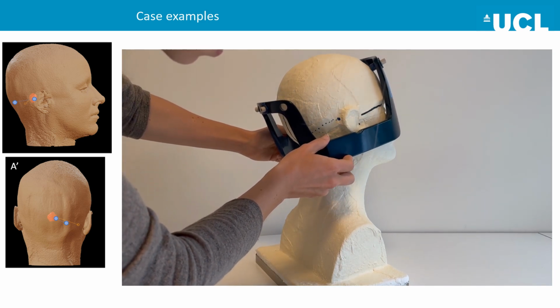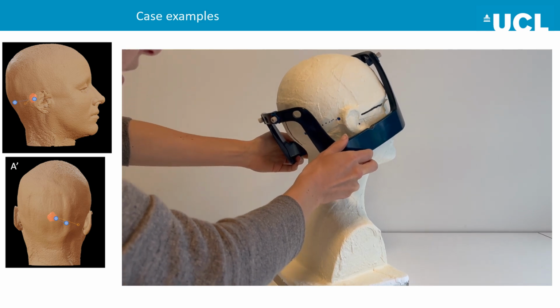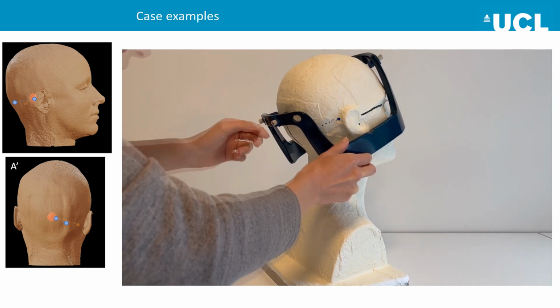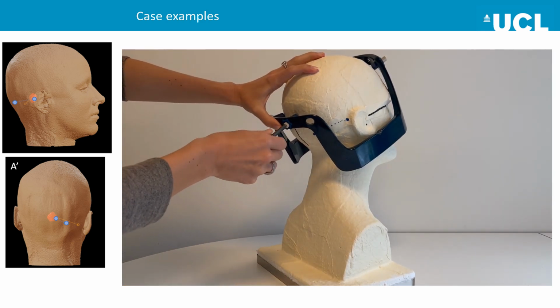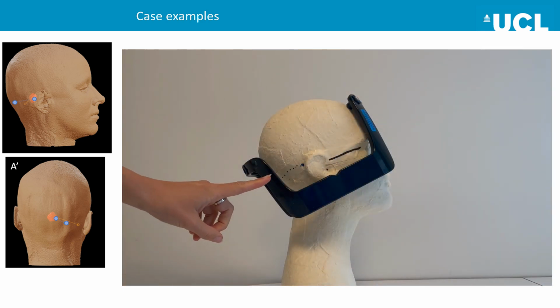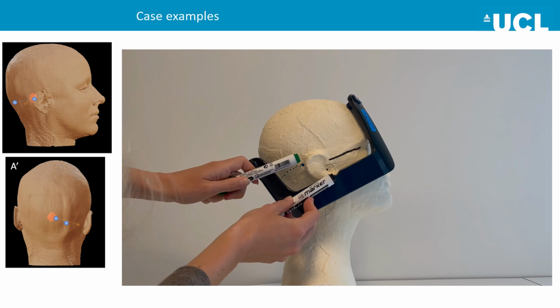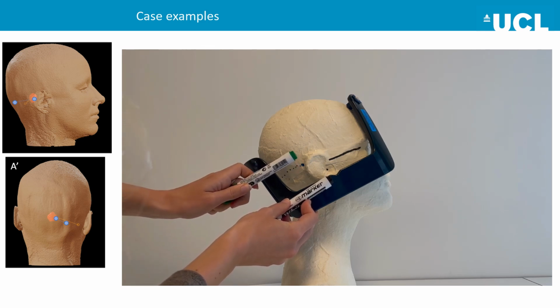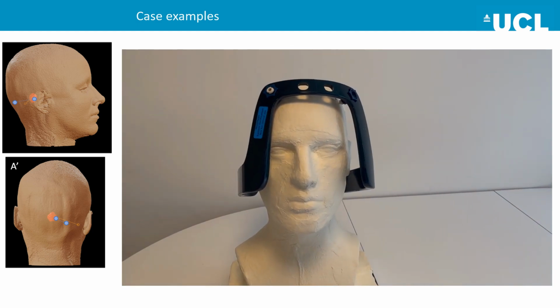So now we want to place the frame with an angle that is less than 180 degrees between the frame and the trajectory. So here you can see that it is roughly parallel to the frame, but ideally the trajectory has a slightly smaller angle. But this should actually work, right? So we're coming a little bit from up down with our trajectory.